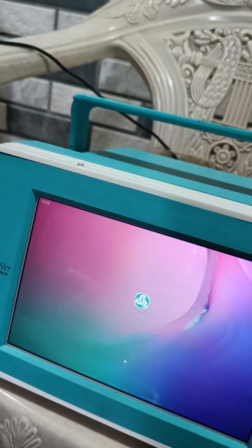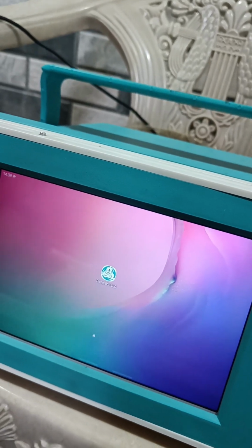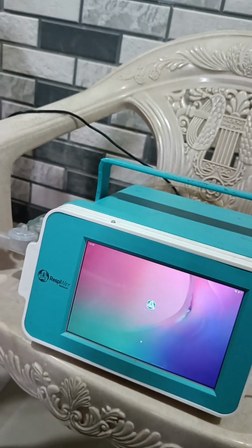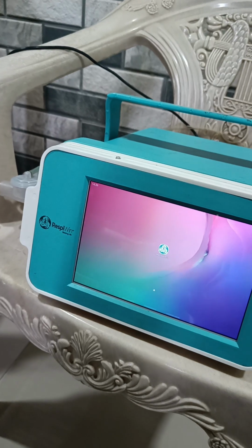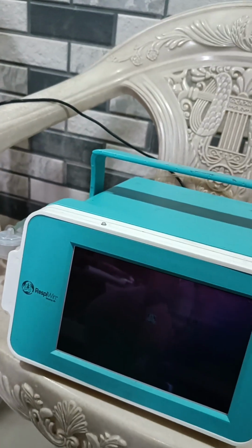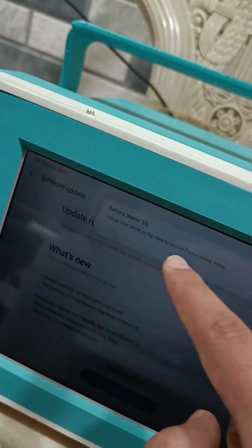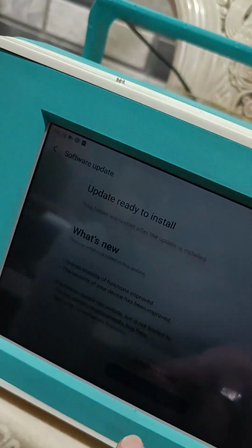This is a ventilator which comes with an inbuilt, Bluetooth connected Samsung Galaxy Smart Tab. So what you can do is start the ventilator and monitor it with this tablet. The battery is low right now.